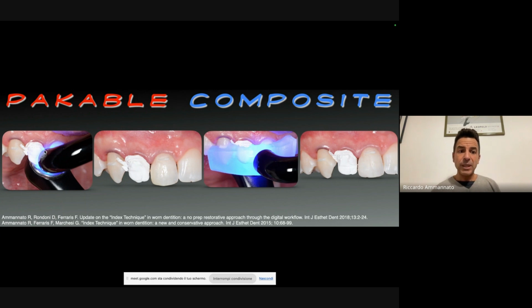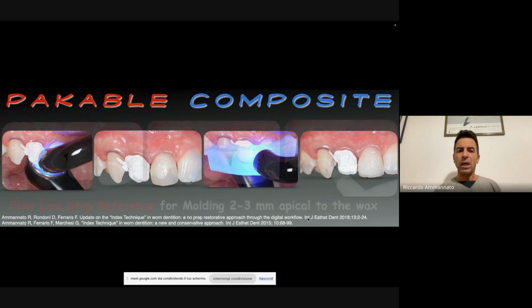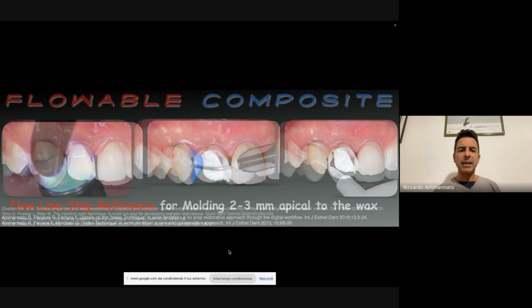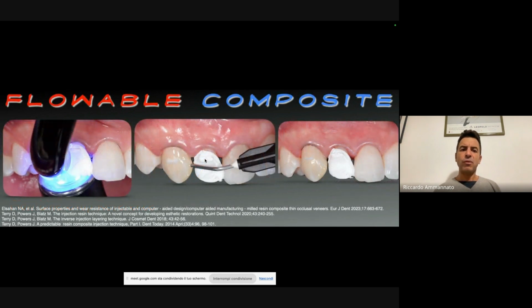However, so this is the curing of the bonding. This is where I'm placing the material, the heated up packable composite. I'm landing with the index, and then I'm going to cure with two curing lights, one from the buccal, one from the palatal, and then I'm going to do my finishing. Now I just want to compare with you guys and share this with you. I'm going to use now this kind of index, the 3D printed one, on the mesial side of the canine. Here I'm doing the adhesion, and then I'm protecting the other tooth with some Teflon.